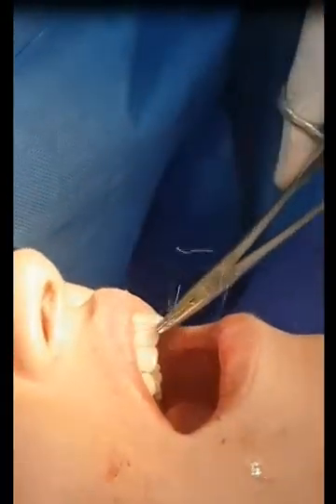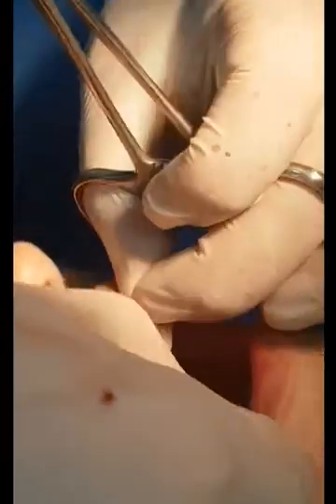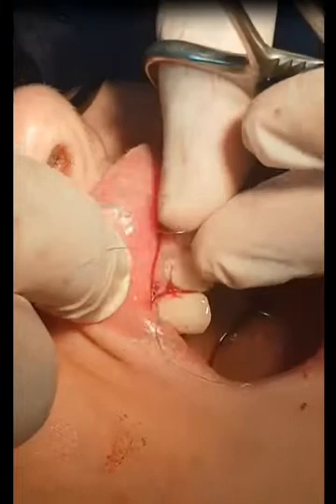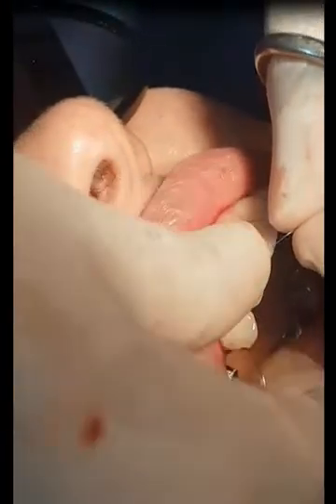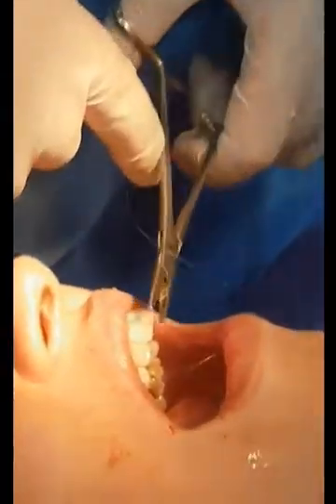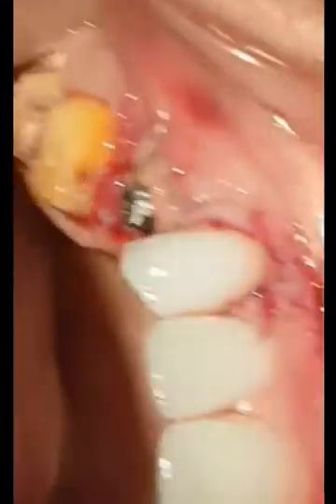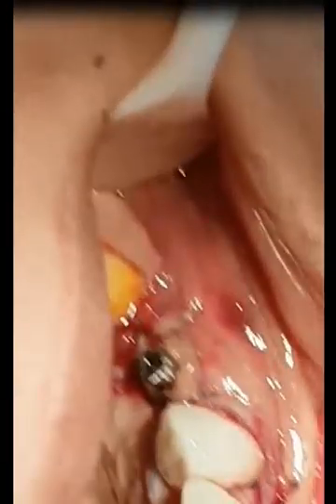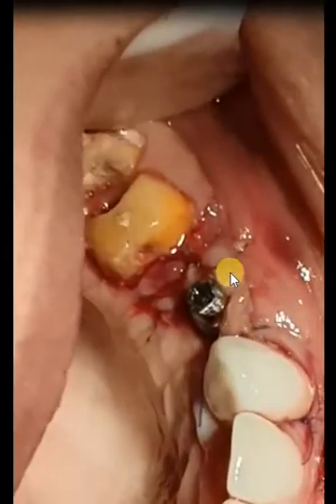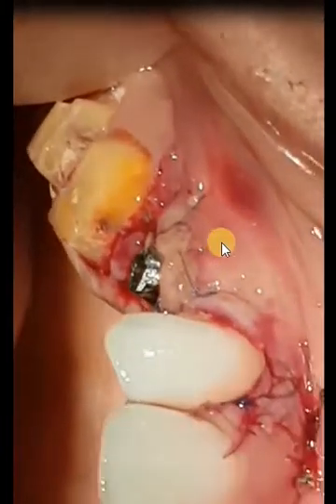The patient should eat soft, cold food. Avoid spicy and crunchy food. She should use systemic antibiotics and analgesics. This is the end of suturing — we are covering the defect area and waiting for the healing process.